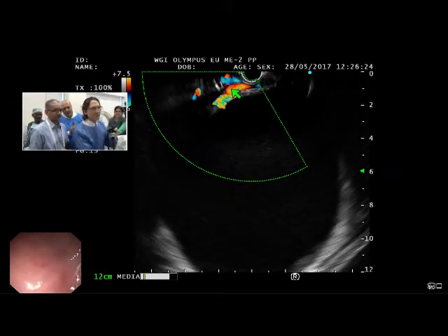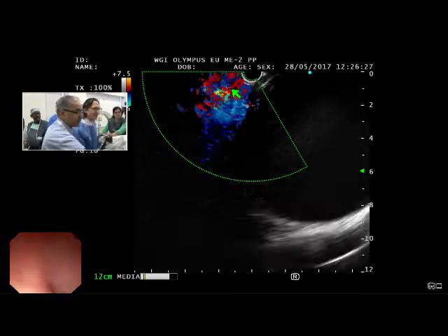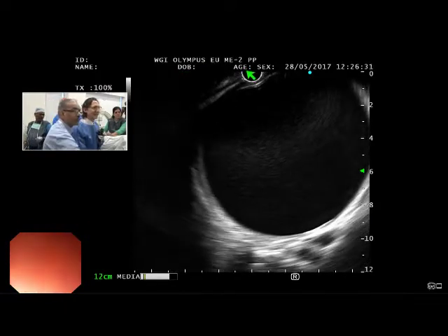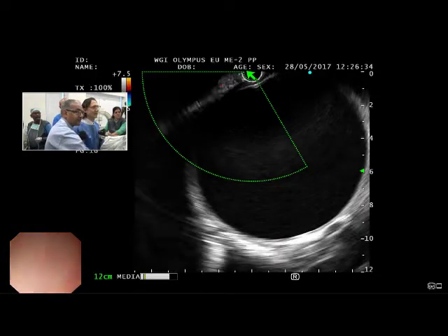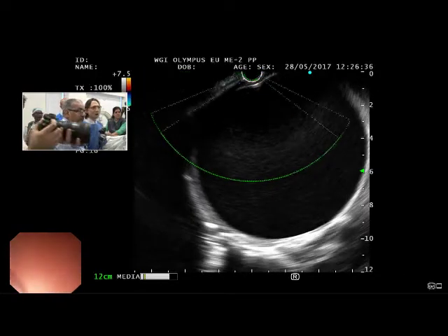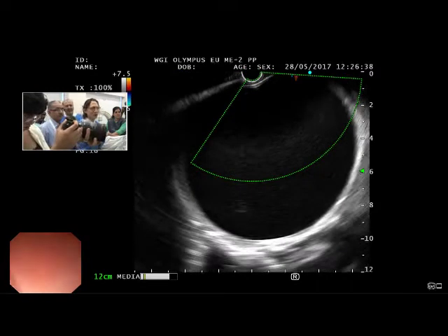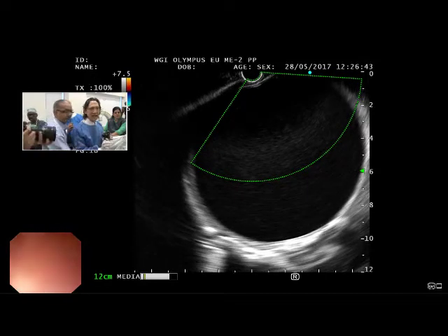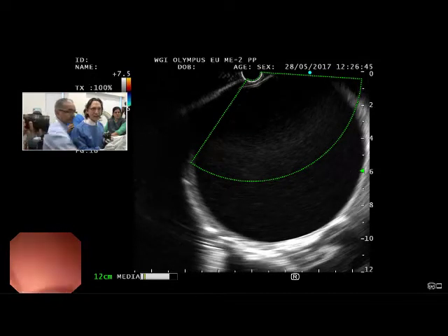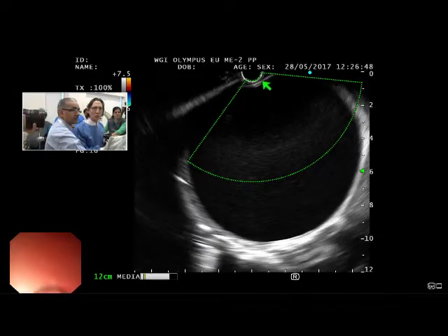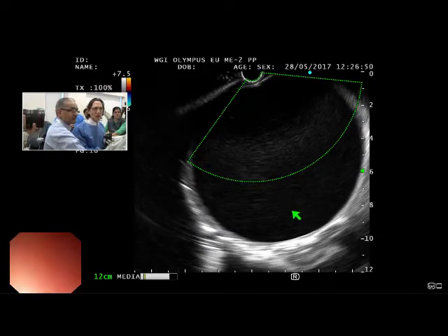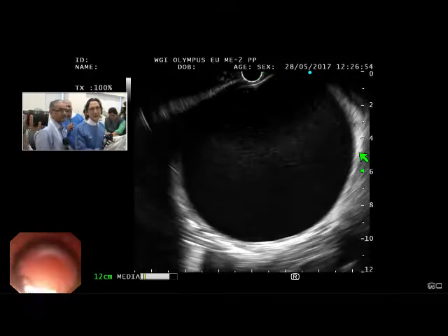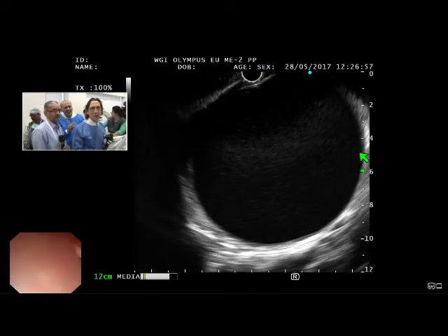This is from the duodenum. Let's go back now into the stomach — the other side where you actually go to put a needle; that side seems to be reasonably clear. So now we're in the stomach, at another site. When we evaluate this cyst, we can see it has a mature wall — that's very important. We can see that the cyst contents look homogeneous and virtually anechoic. There's really no necrosis here.